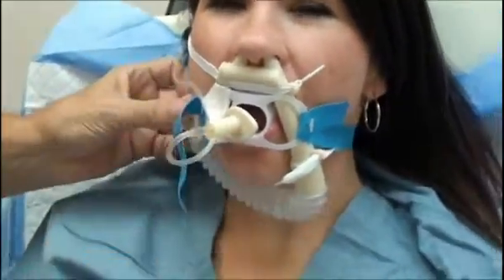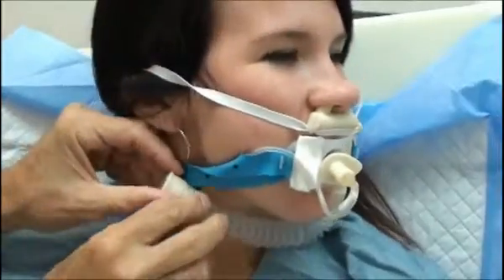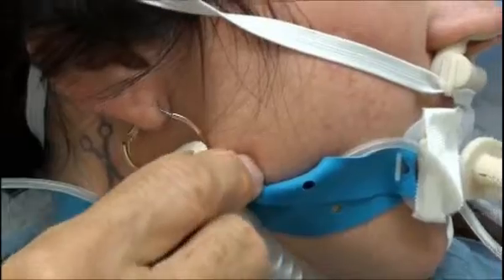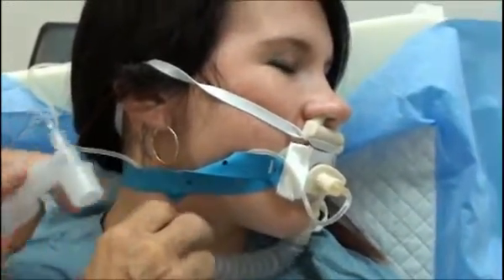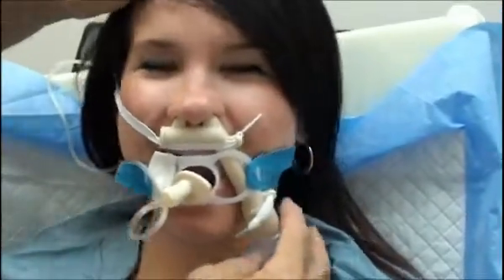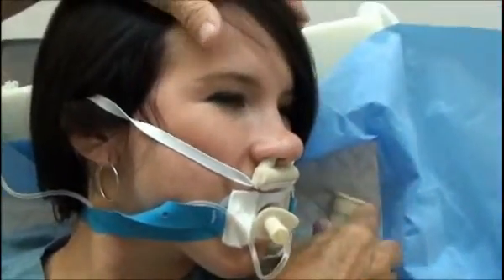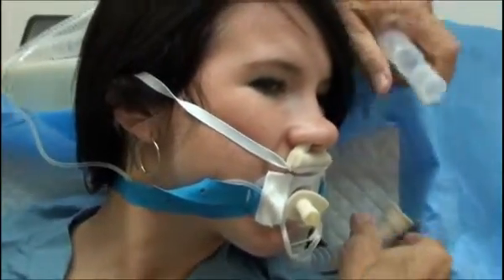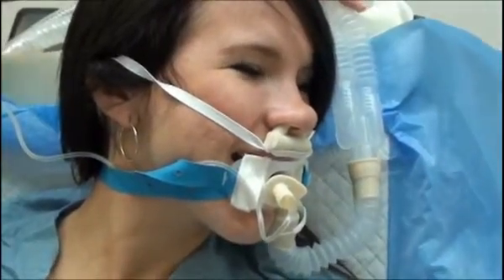When you're lying on your side, we either bring this out — turn your head that way a little bit. You're usually lying on your side or on your stomach, and we bring it out this way and attach it to the anesthesia circuit on this side, usually. But sometimes it works out better to hook up the anesthesia circuit on the other side — whichever is the most out-of-the-way position for your endoscopist.